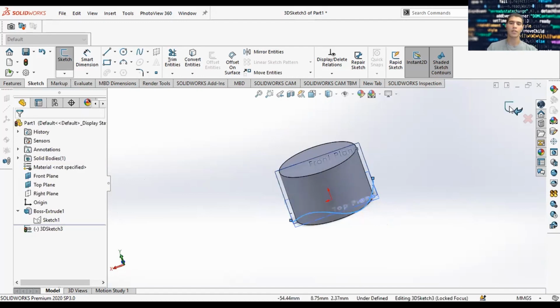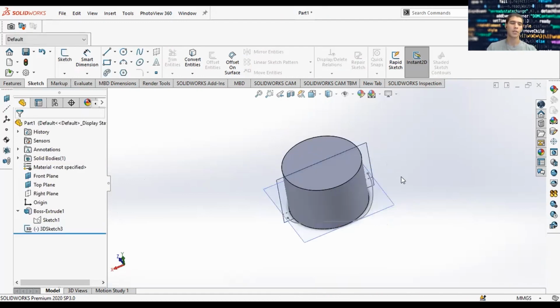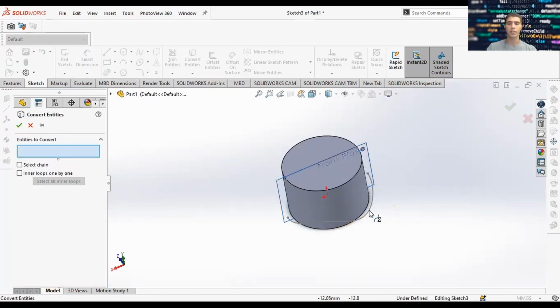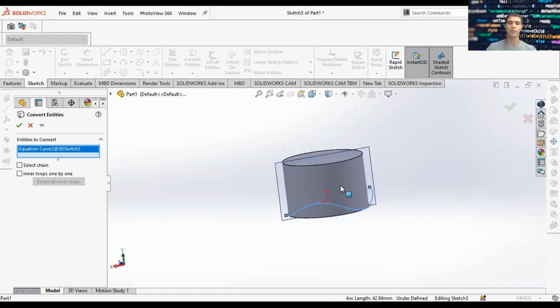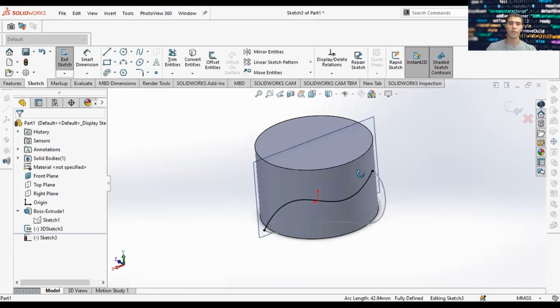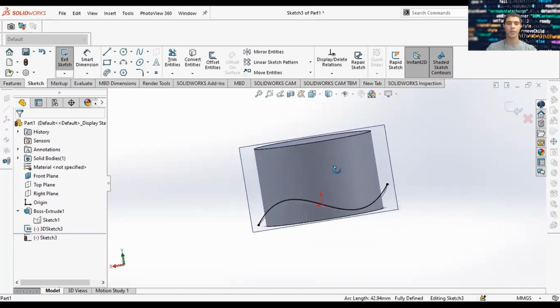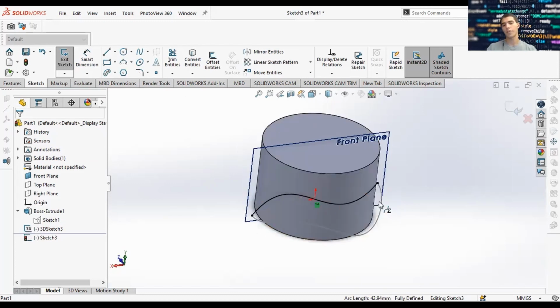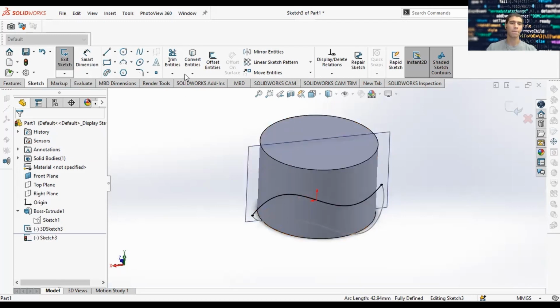Now we accept the sketch. What we want to do now is go to our front plane, and on our front plane, we're going to make a sketch. Here we go to convert entities, and we're going to select the function-driven curve we have. We're going to project it onto our front plane. And so now we made a kind of cross-section of our function-driven curve on our front plane.